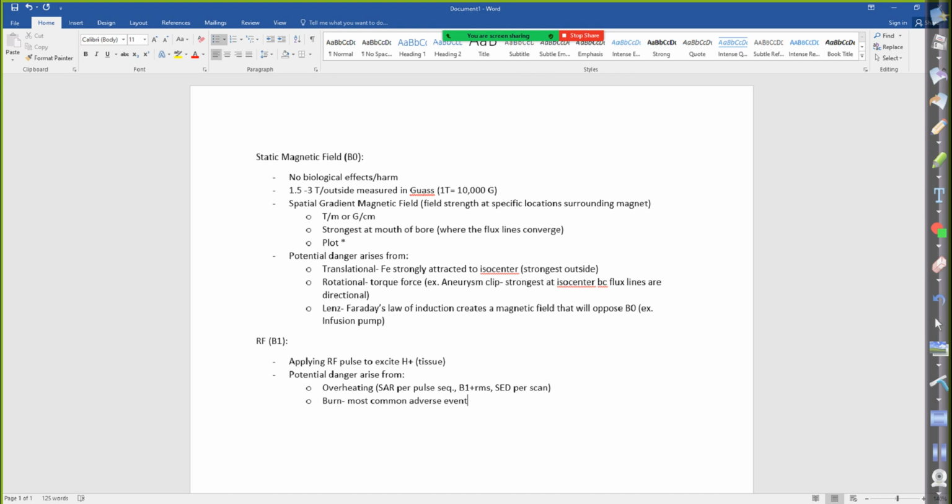So just think of like almost like thermionic emission. You have a very small coil in X-ray. You got all those electrons getting pumped to it through the filament circuit. You get boiling off of those electrons because of thermionic emission, and it's just like they have nowhere to go. It's all that crowded with electrons on a thin filament wire. No, they just get boiled off. So burns, okay, most common.